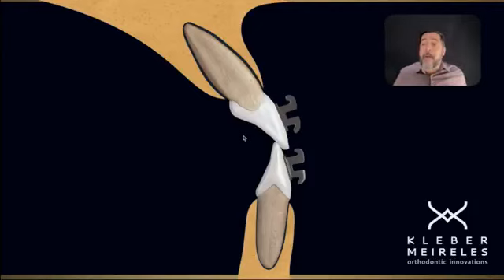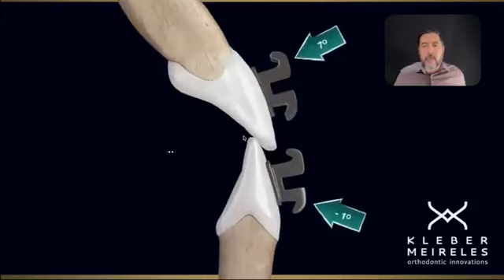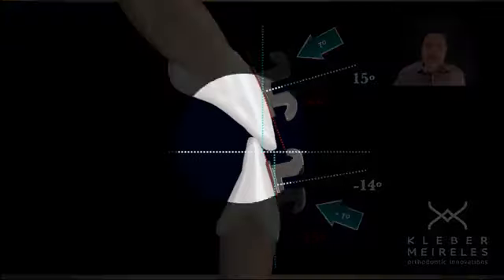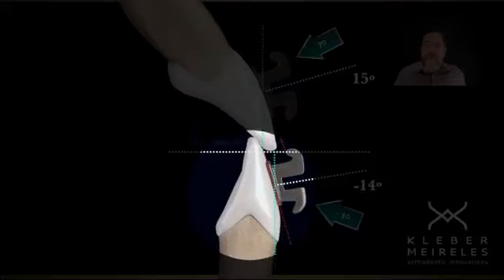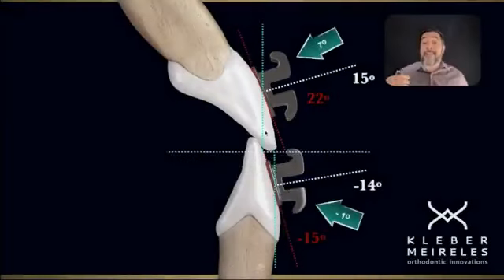And I have a standard straight wire prescription. Roth or Andrews, they are very close in inclination in the anterior segment. So we have here 7 degrees embedded in the slot in the upper arch, and -1 degree in the lower. But the inclination of the crowns is very different from this. They are completely different because we have a compensatory inclination of both upper and lower anterior teeth.